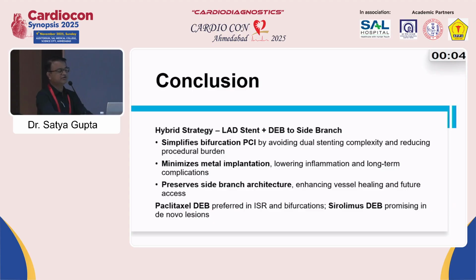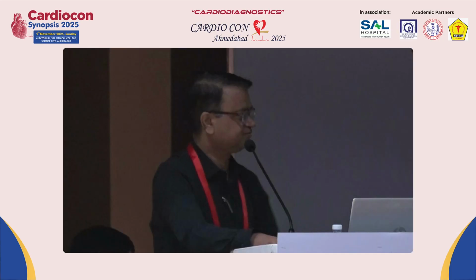So in conclusion, I would say given a choice, a stent in the one main vessel and the drug-eluting balloon in the side vessel is always better than doing a fancy procedure with two stents, putting a stent in the main vessel as well as the side vessel. Thank you so much.